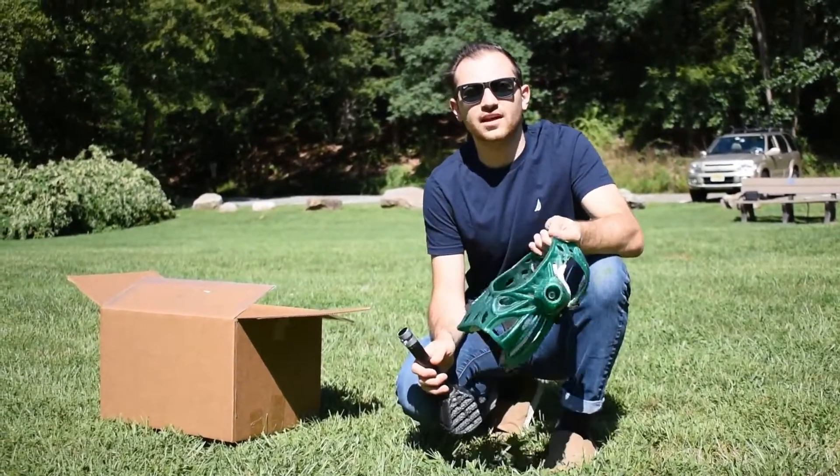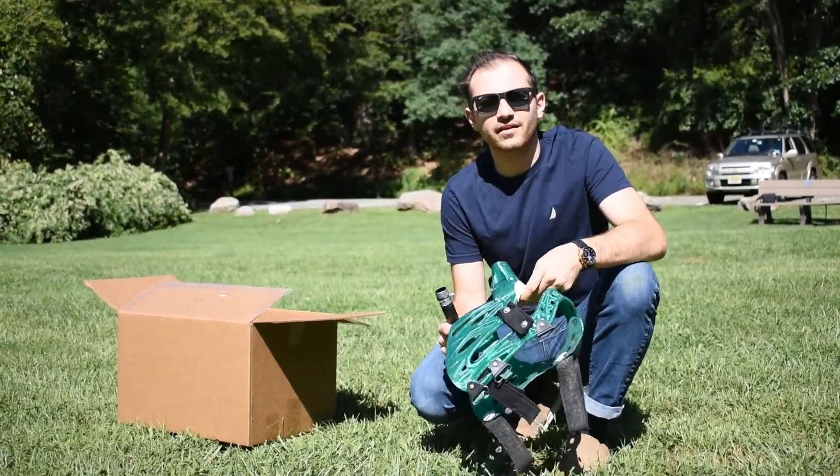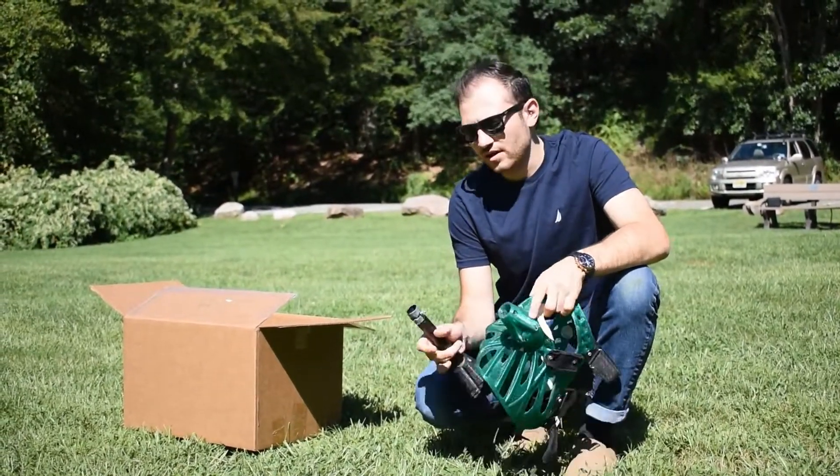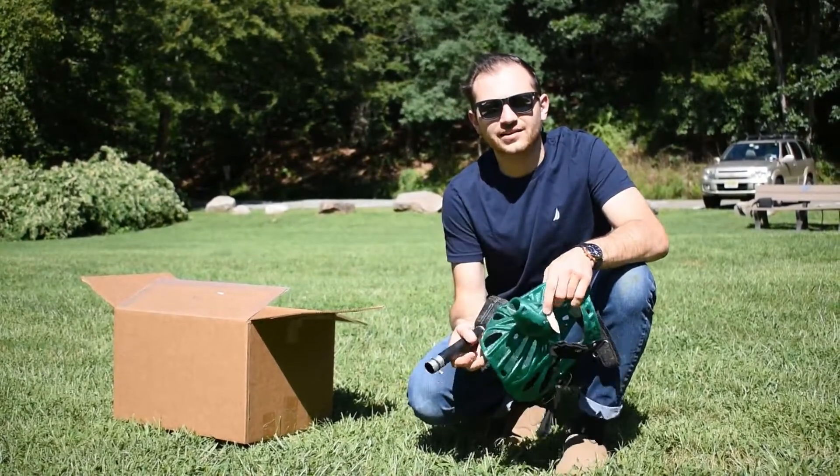So now it's a few days later. Your pup has gotten a little bit more comfortable with the jacket and the prosthetic as a whole — either they're comfortable being around it and/or wearing it, which is great. The next step is going to be fitting the leg, and then we're going to get some photos to send back to us to make sure everything is looking okay with the alignment.